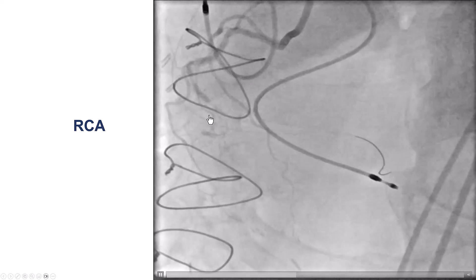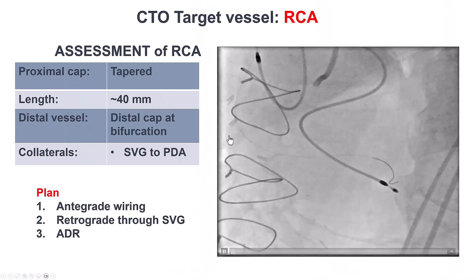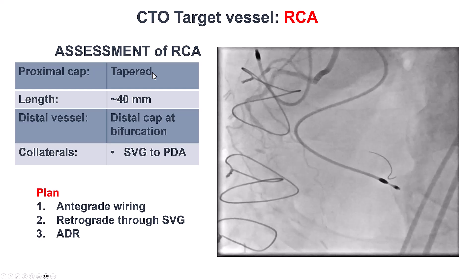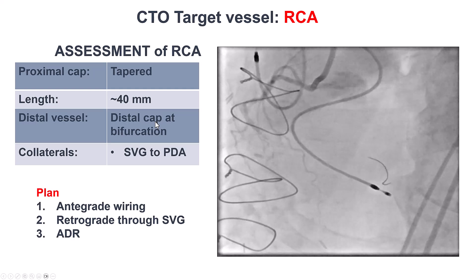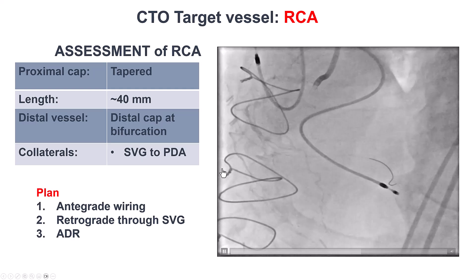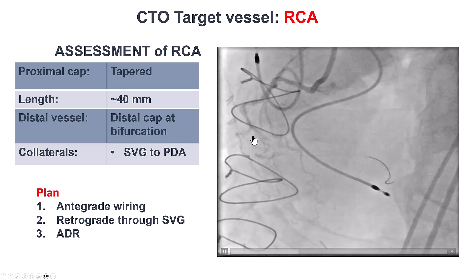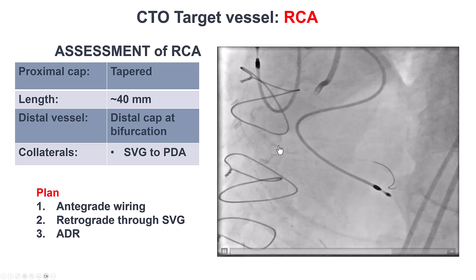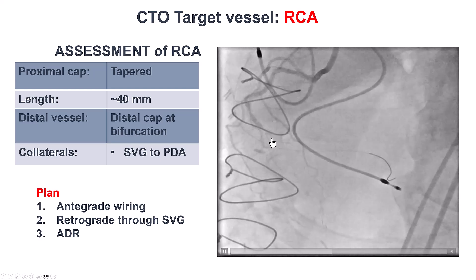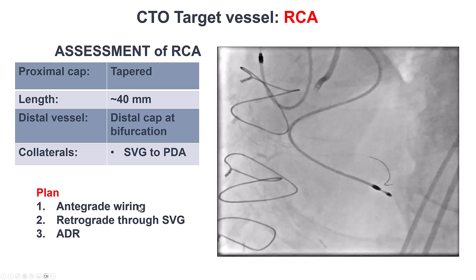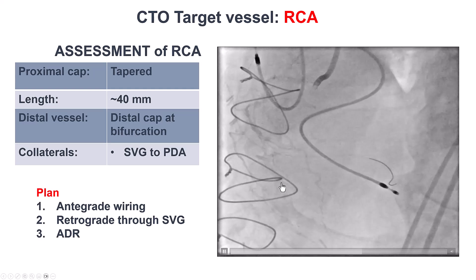Injection of the right coronary artery shows that the proximal cap has a tapered morphology — tapered but clear. Length is about 40 millimeters. There is a bifurcation at the distal cap, and the PDA is filling through the vein graft. Our plan was to first try antegrade wiring, since the occlusion was not too long and there was a clear proximal cap. But if that didn't work, we had a low threshold to convert to retrograde through the saphenous vein graft. The last resort was ADR because of the presence of the bifurcation on the distal cap.